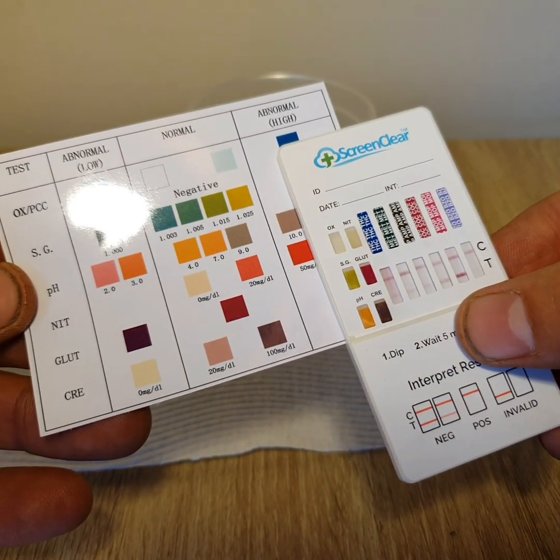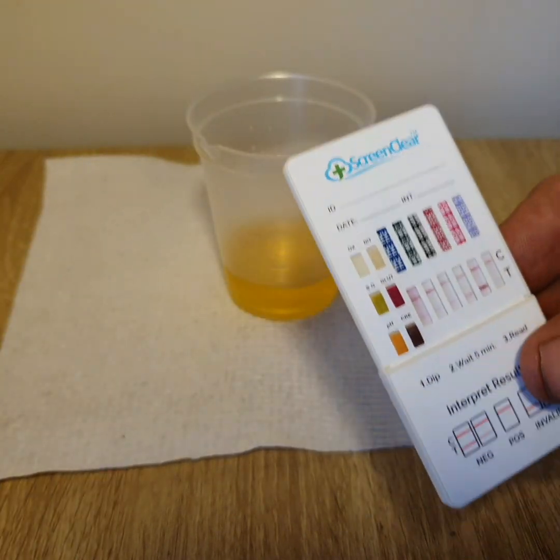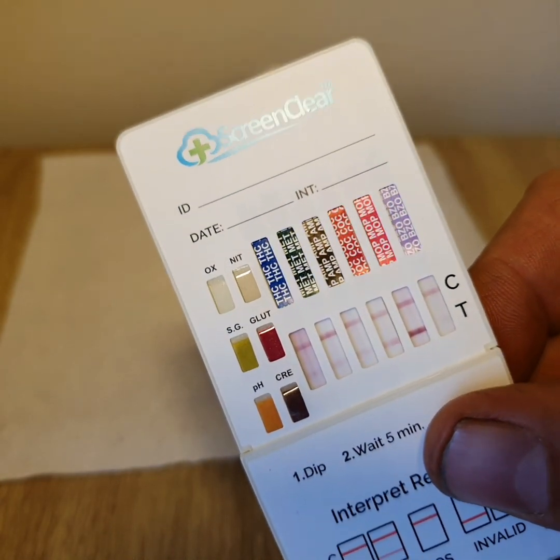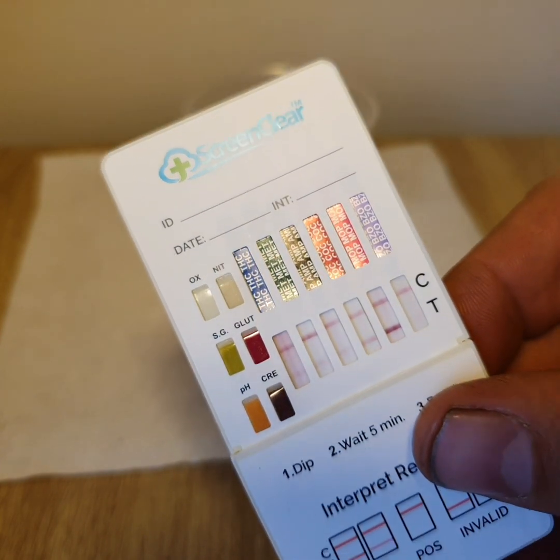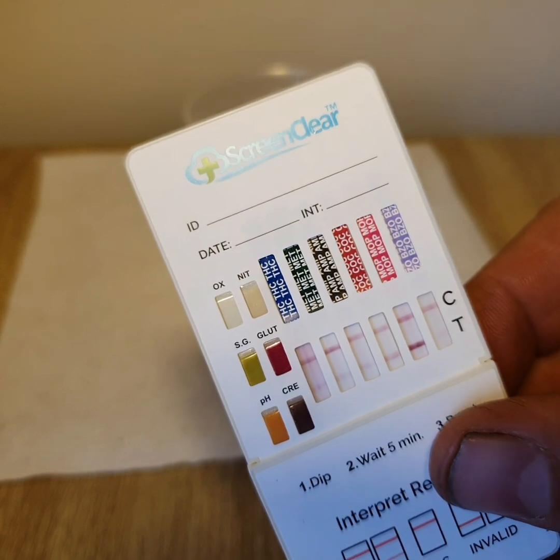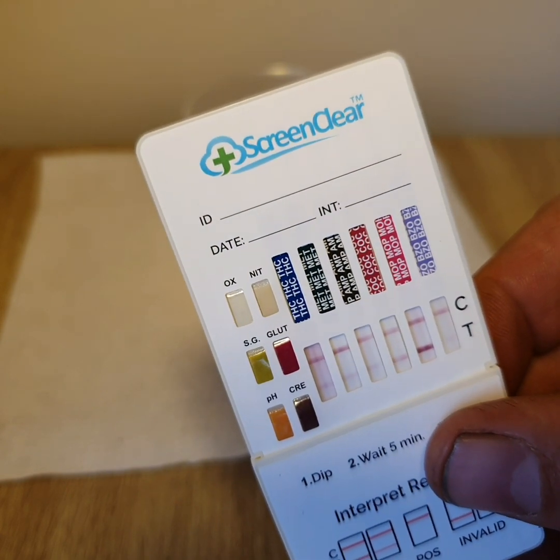If you do get an abnormally high or low adulteration result, it's recommended that you do a retest or get another sample. And if that doesn't pass the test, then it's recommended to get laboratory confirmation. But this one looks good, so now we can move on to the drug test.